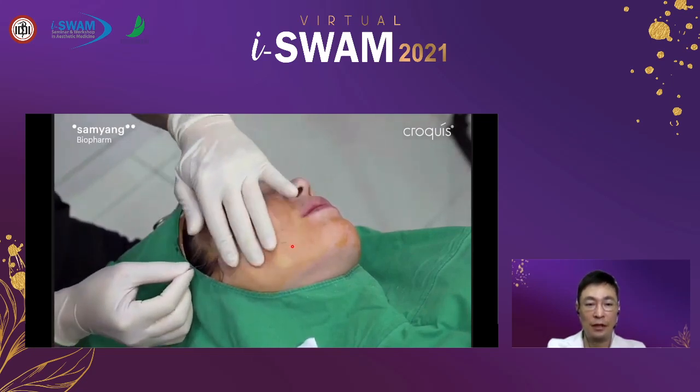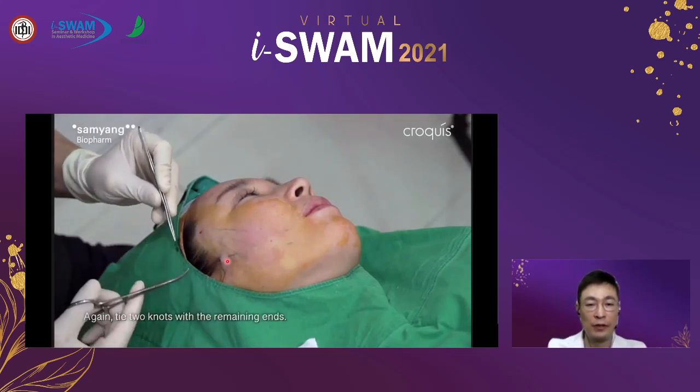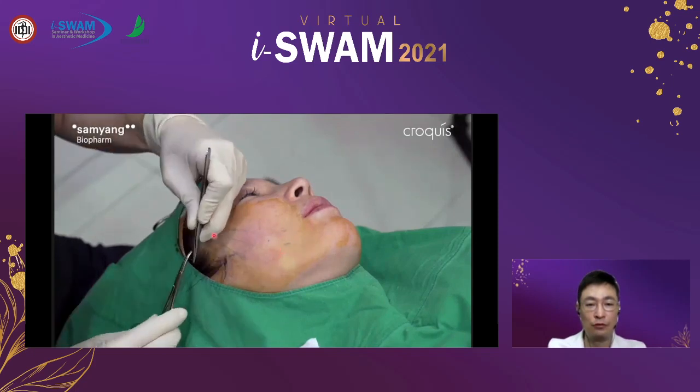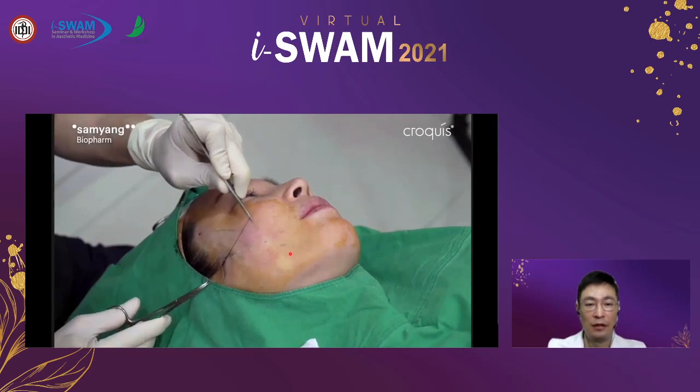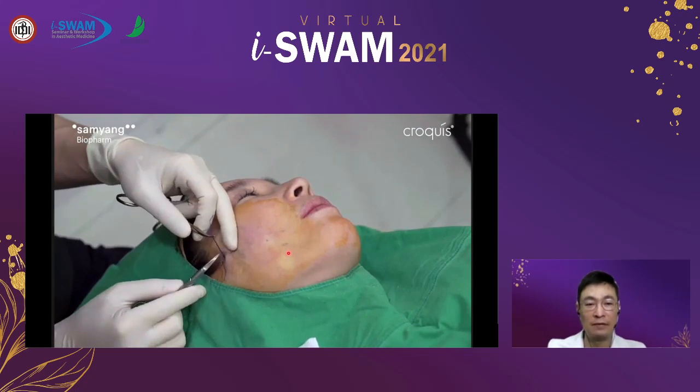And then tie again. This direction is very useful when lifting jowl, and there will be 2 vectors for jowl lifting, and eventually the jowl fat will be effectively lifted.